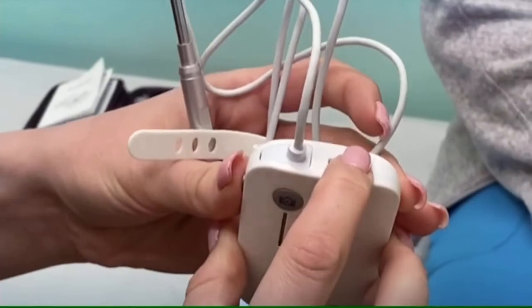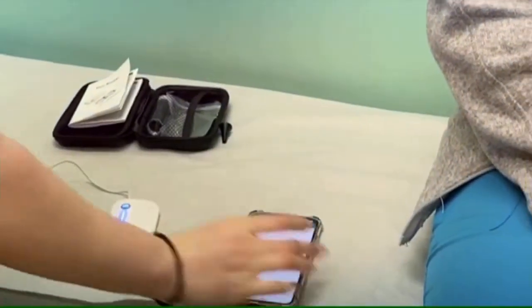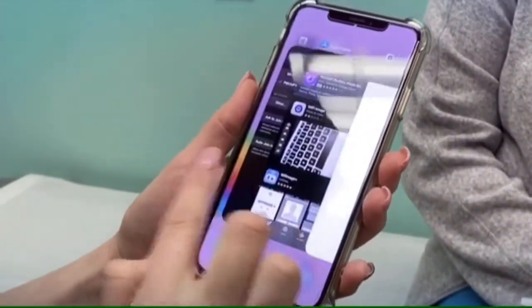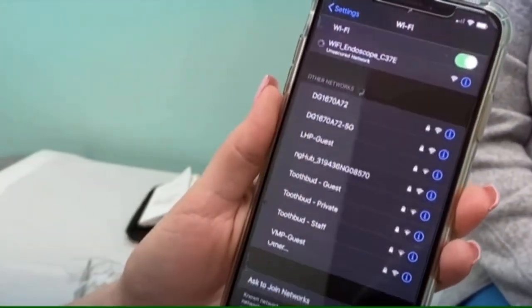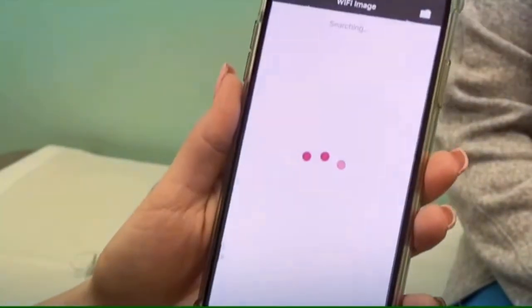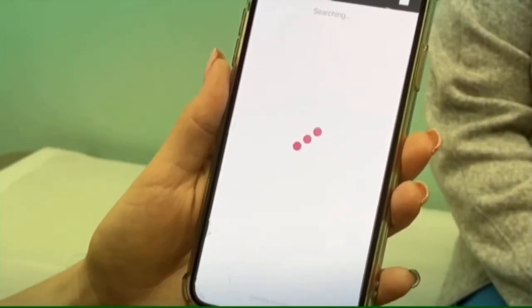You're going to want to go ahead and turn the device on — it's right here at the top. We're just going to press and hold that until it lights up. It's on, and then it's now telling us to get set up on the Wi-Fi. So we're going to head over to our settings, pop in there, and then head back over to the app. It's going to look for it — connecting.